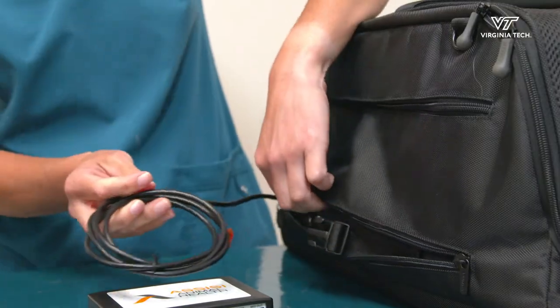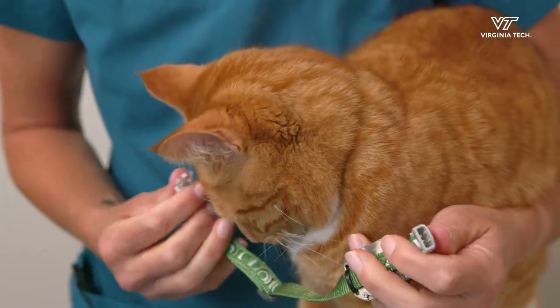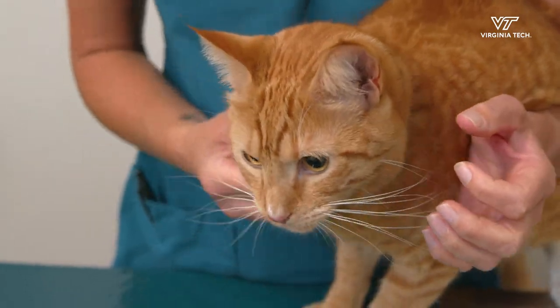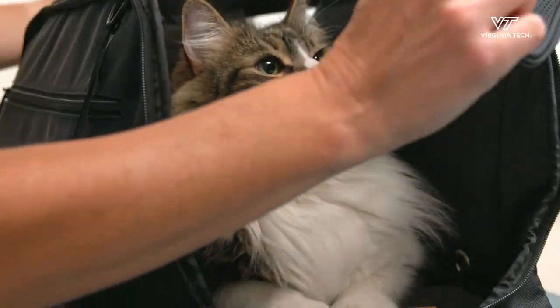After the treatment, unplug the cord from the box and place it back in the lower zipper. Put the Assisi Loop box in the top zipper. Don't forget to fasten the activity monitor and collar back on your cat after their treatment. Please remember to record all of your treatments and take pictures of your cat in the carrier to upload to REDCap.